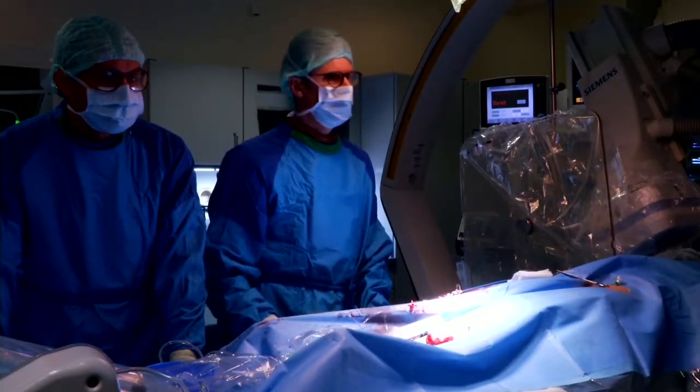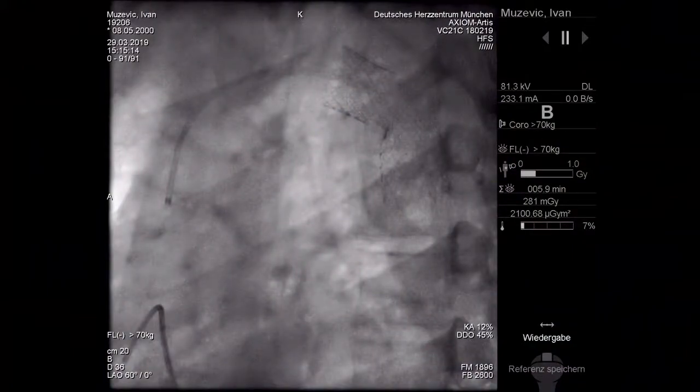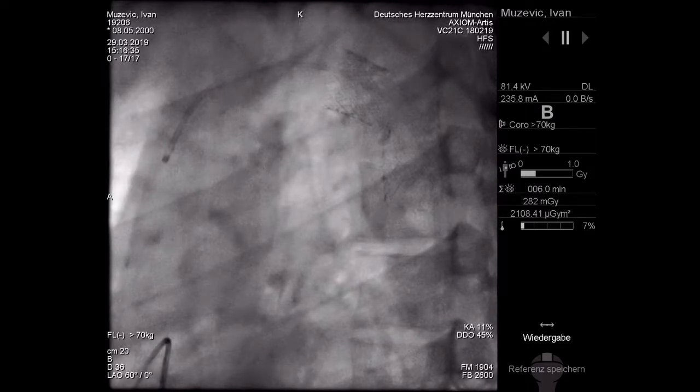Please show it for the audience. So this is the stent situation now on the top. I think we try just to dilate the upper part of the first stent, at least. I tend to take an Atlas balloon perhaps, because I think we need more pressure than what we needed to implant the other balloon. What do you think? Or should I just give it a trial?